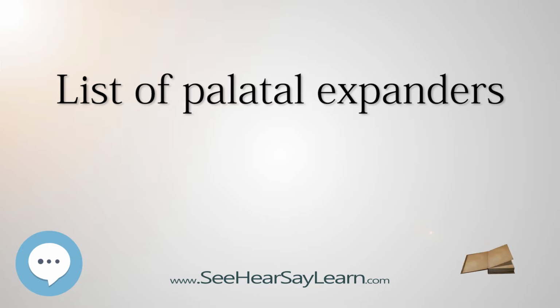In both methods, RME led to buccal movement of the maxillary posterior teeth, by tipping and bodily translation. They also mentioned that the second premolars displayed more buccal tipping than the supporting teeth and this could be due to second premolars not being banded to the appliance.